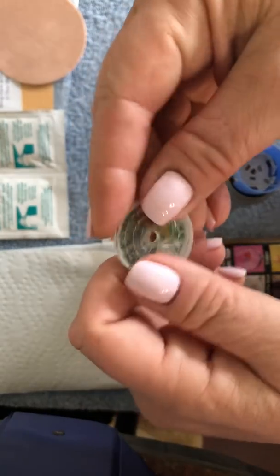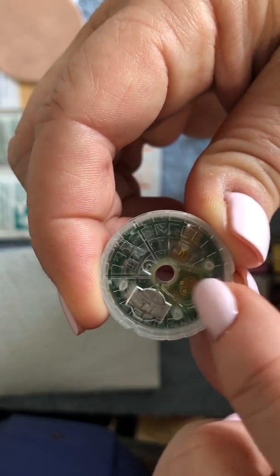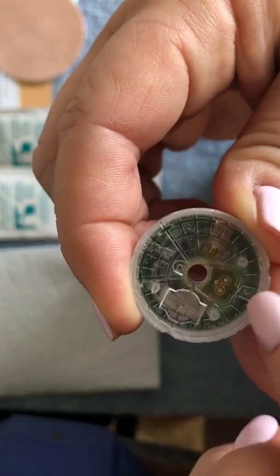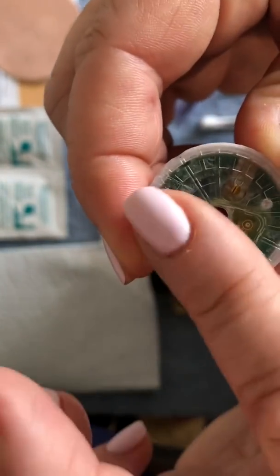So if you feel on here, you'll notice that there's still some tackiness on there. It's really important that you try not to get too much stuff in this triangle here. I don't know if it would affect the disc or not, but I'm always cautious of it. So again, it's still very sticky on the side.